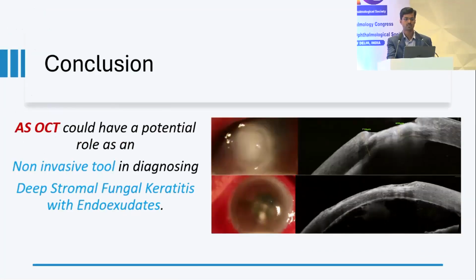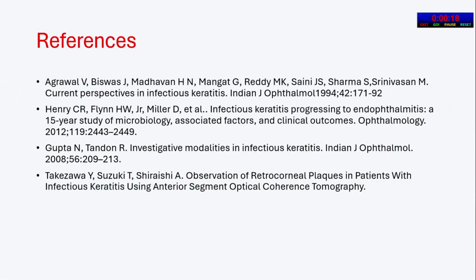Coming to the conclusion, anterior segment OCT has a potential role as a non-invasive diagnostic tool in detecting fungal infections with endothelial exudates with intact corneal epithelium. These are my references. Thank you.